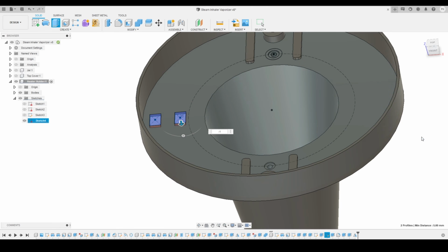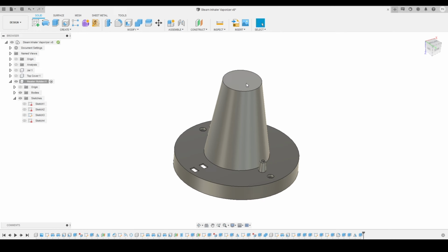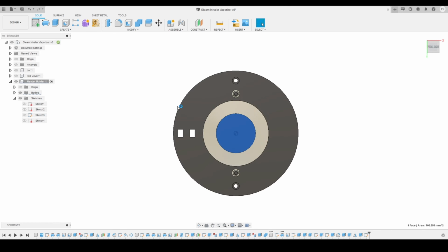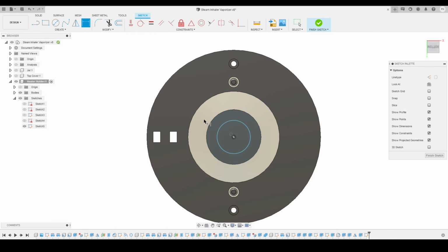Here you can see what we had created so far. Now we'll select this top face and click on create a sketch, and here we are also going to create a hole. So I will just create a circle like this, and I'm going to define the diameter of this circle. The diameter of this circle is 20 millimeters.